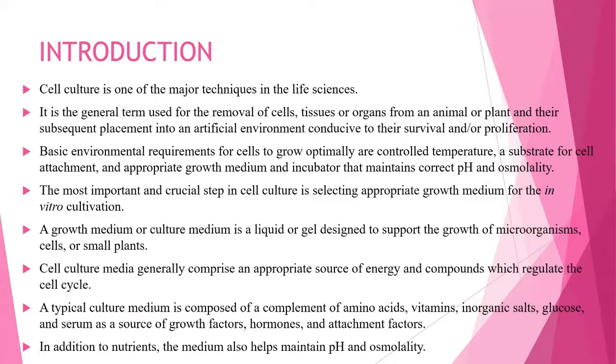Cell culture is now a prevalent technique, and many people are getting well versed in this. Even for finding jobs in many companies, like biotech companies with wet lab work, they prefer people who have hands-on experience in cell culture.